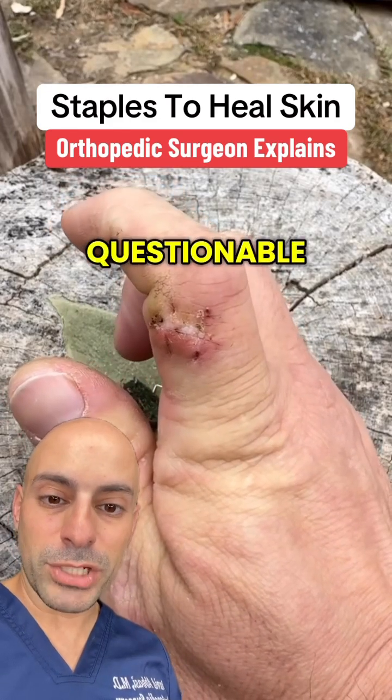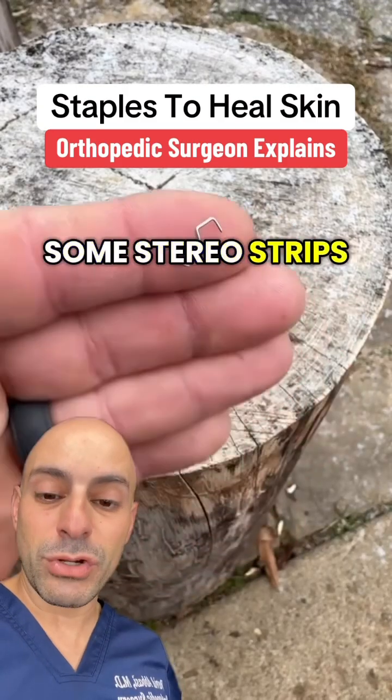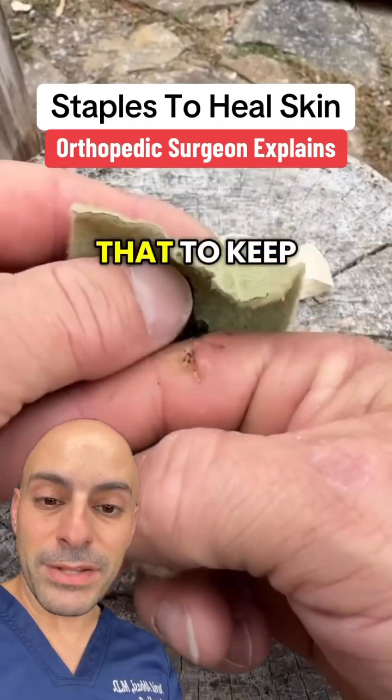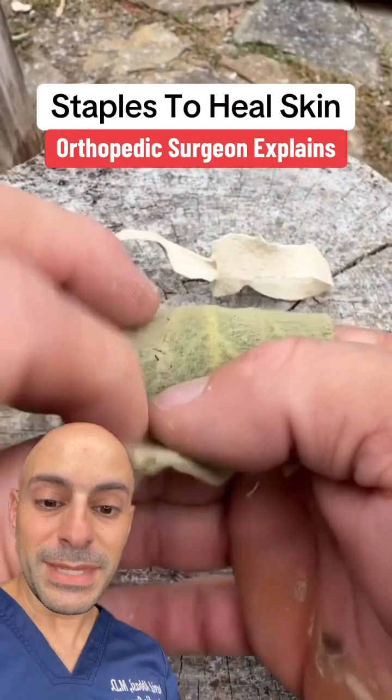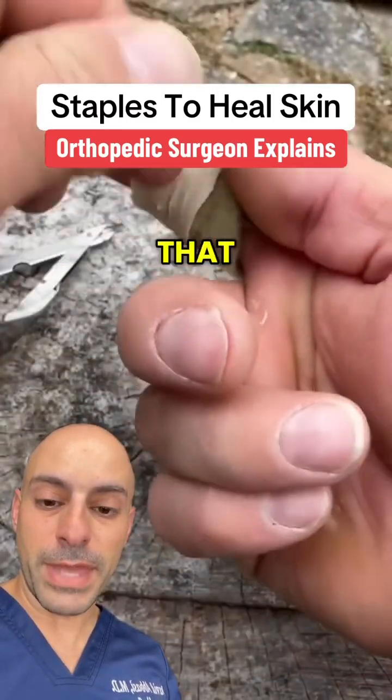That one still looks a little questionable — it looks like there's some movement by that wound. I would at least want to put some Steri-Strips or stickers on that to keep it intact. But yes, we do use staples in surgery, or I guess in nature, to close wounds like that.